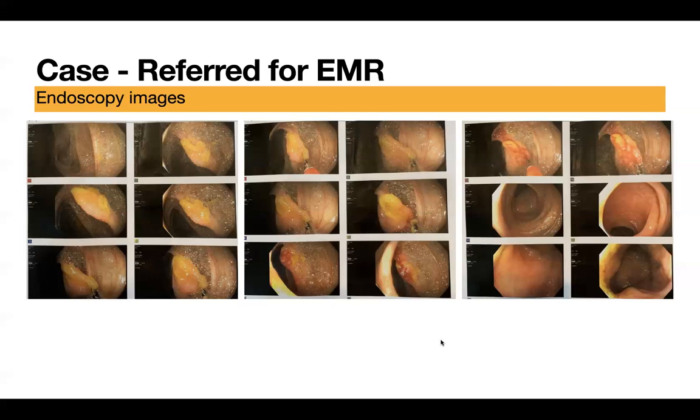And I want to ask Selvi to comment. Actually, Selvi and Bill reviewed our own records at one time, based on the photographs. Do you want to comment on that? Long time back. Yes, it was a long time back. I think just a couple of comments. It is important to clean, and from a medical legal standpoint, it's important to do photo documentation of the colon landmarks that you just described, Raju.